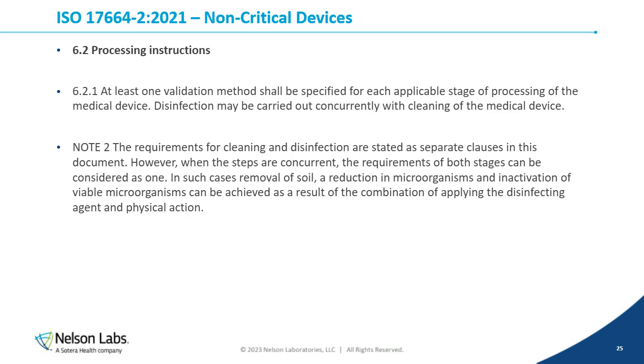So essentially what this means is, oftentimes for non-critical devices, the product you're going to use for cleaning is the same product you're going to use for disinfection. So you can do validation work to show that both processes are effective in one validation. So you can do a combination cleaning and disinfection validation.